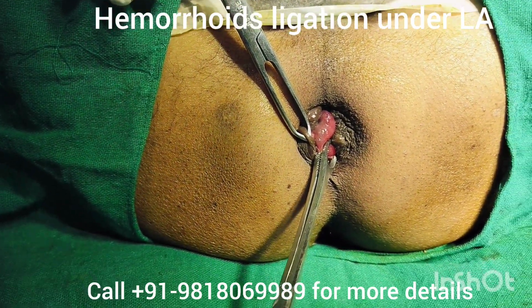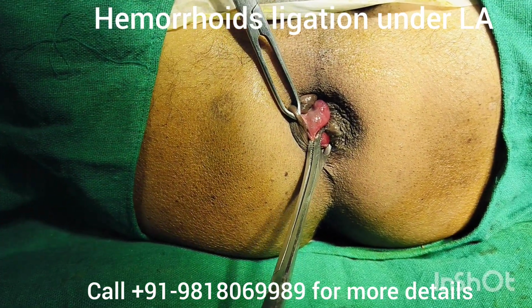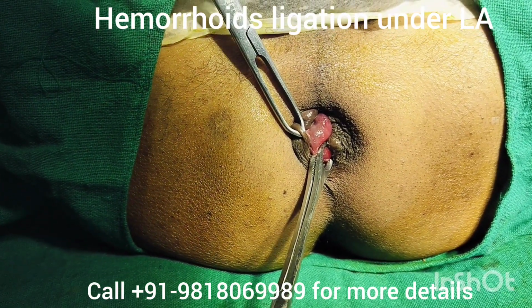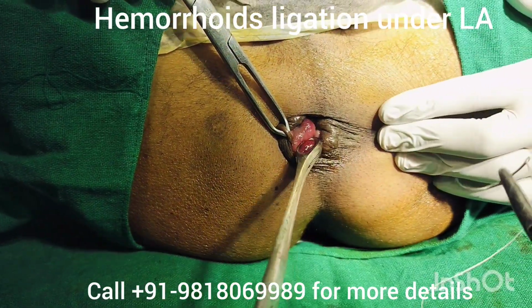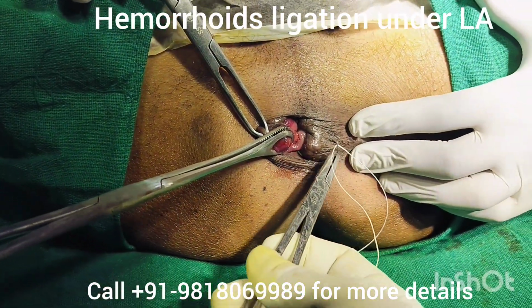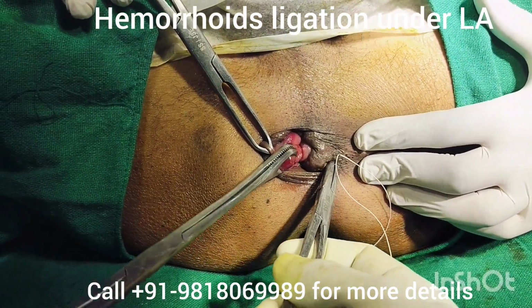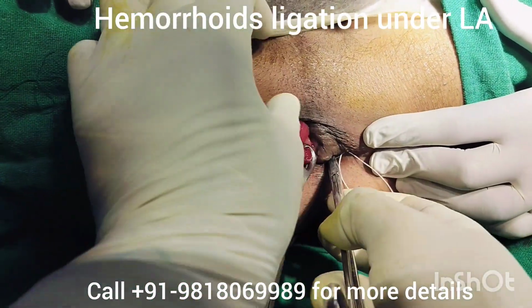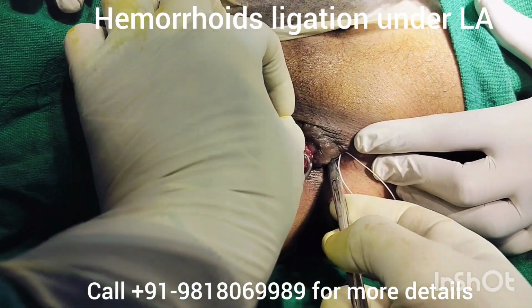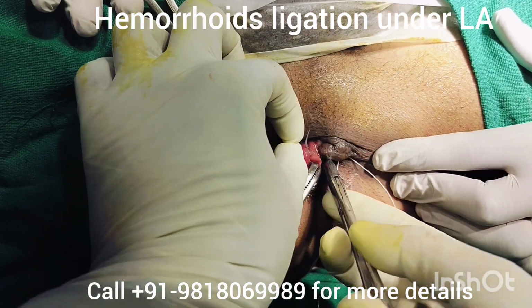The pedicle at its base will be transfixed at base and will be ligated. We have used 3-0 linen thread here, and this is transfixation of pile mass at 7 o'clock position.